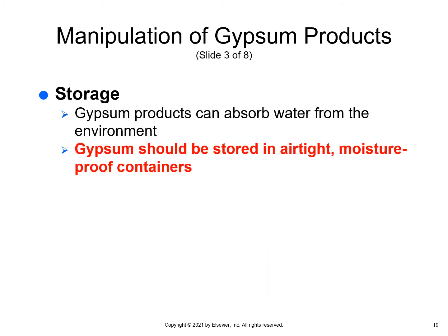So for storage of gypsum products, obviously it can absorb water. So we need to keep this in a dry, cool environment. So they should be stored in an airtight, moisture-proof container.